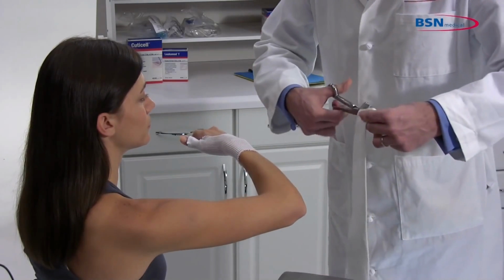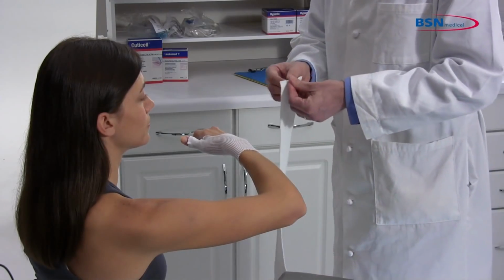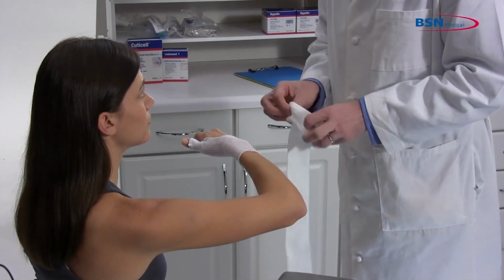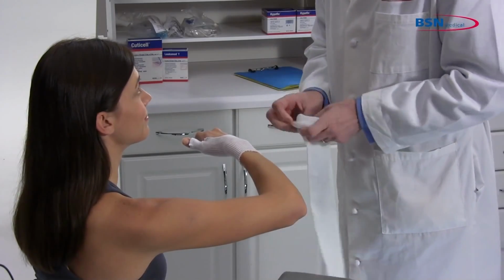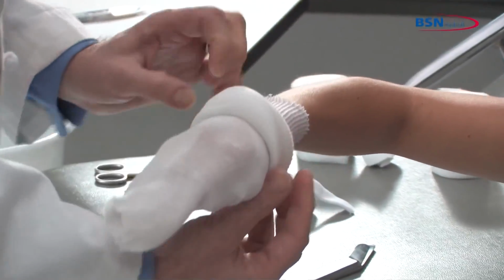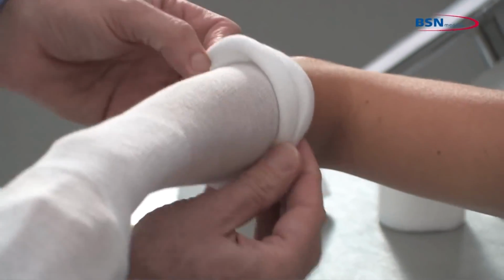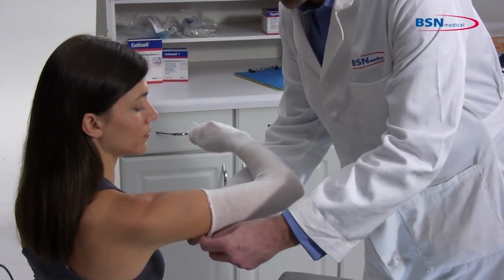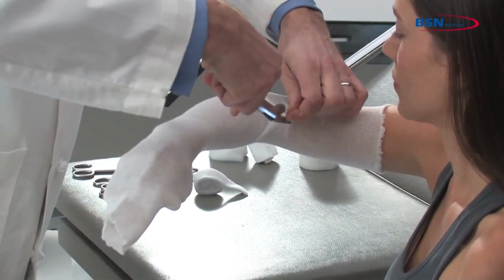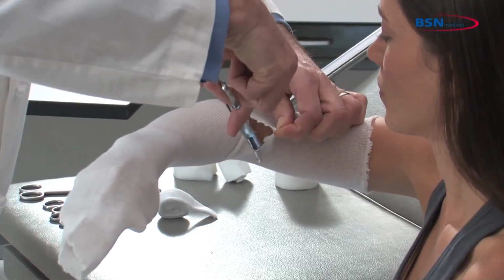Select a stockinette that will not be restrictive at the widest part of the limb. Make sure you use enough stockinette to allow foldbacks at distal and proximal ends. Now, roll up the stockinette before applying to the limb to lessen pressure while applying. Roll on and remove all wrinkles and creases. A small cut in the antecubital fossa may be needed to remove fold.